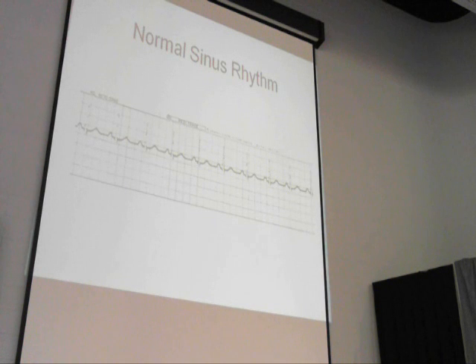And try to stay away from memorizing things, but when we start looking at those heart blocks, the four heart blocks we're going to look at later today, there are classic things that go along with the PR interval, the characteristics and the relationships between P's and QRSs. And we're going to look at those in detail. And then the PR interval, which somebody mentioned earlier, that's the time frame.